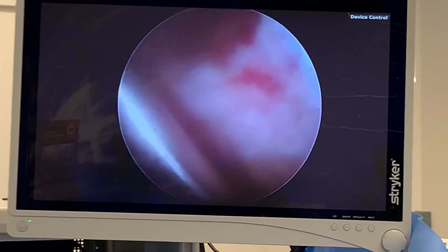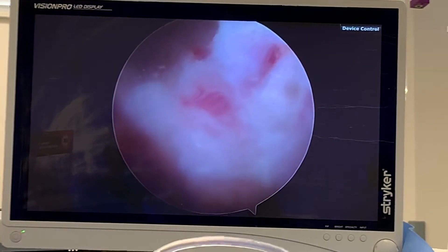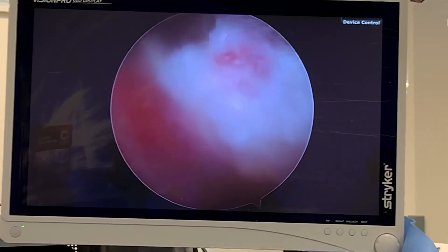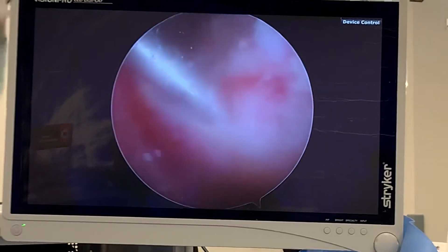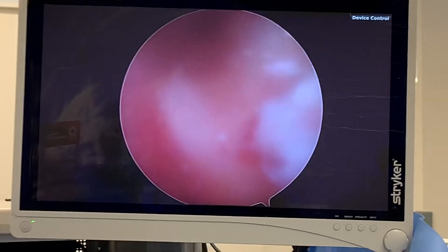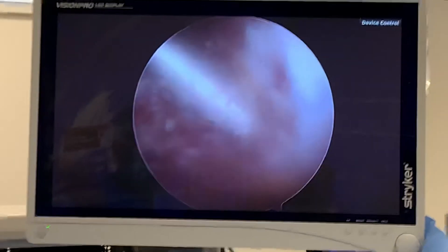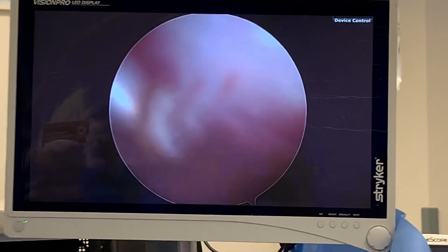That was the hole — or the cocoon, or the pocket — where that calcium was at. And I think I got it all out. Yeah, see — it was like a little pocket, and that's why it formed, looking like a little blister into the rotator cuff. Let me clean this up a bit so you can see a little better and stop the bleeding here.